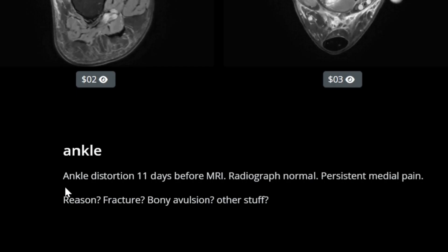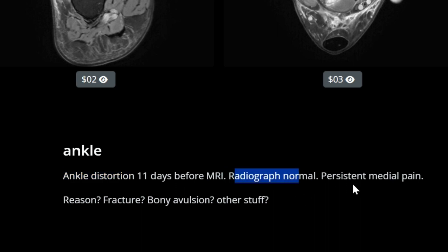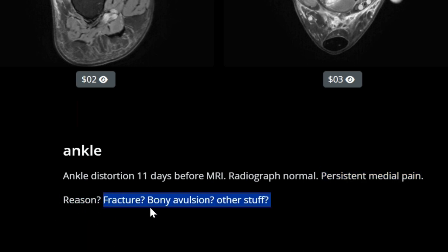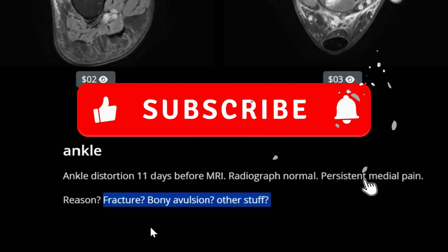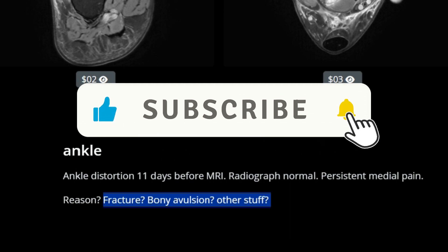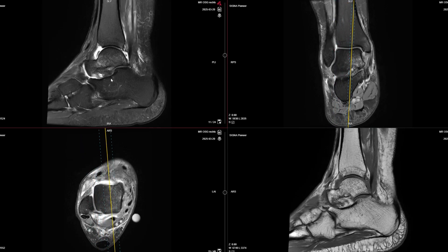Here is the case - it's an ankle MRI. There was an ankle twisting or distortion injury 11 days before the MRI and the radiograph was normal, but the patient has persistent medial pain. The question is what's the reason for the pain - is there a fracture, bony avulsions, or any other pathology?